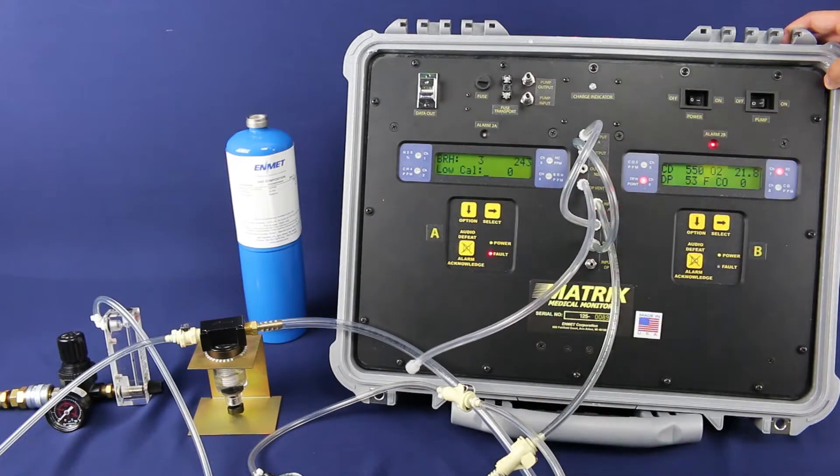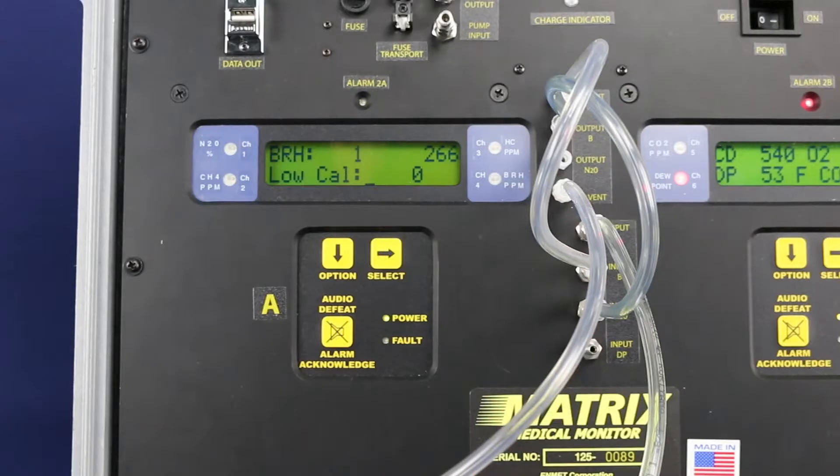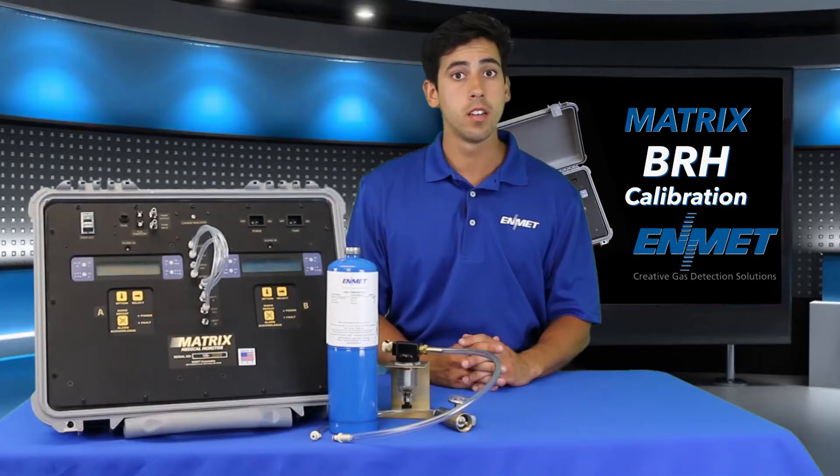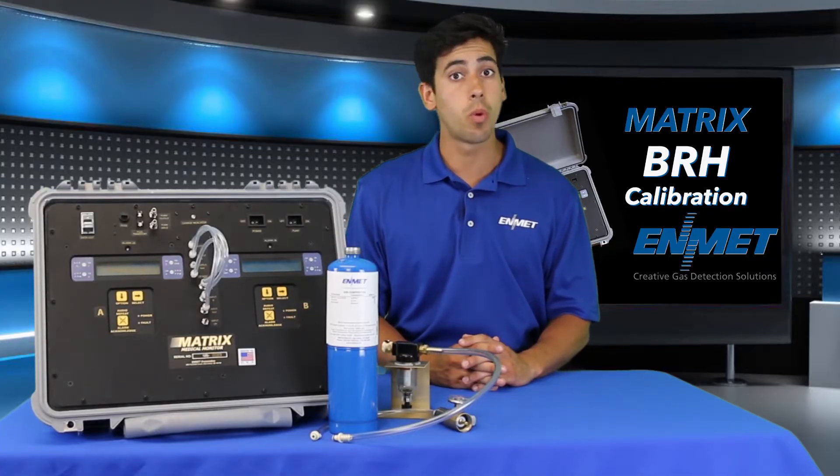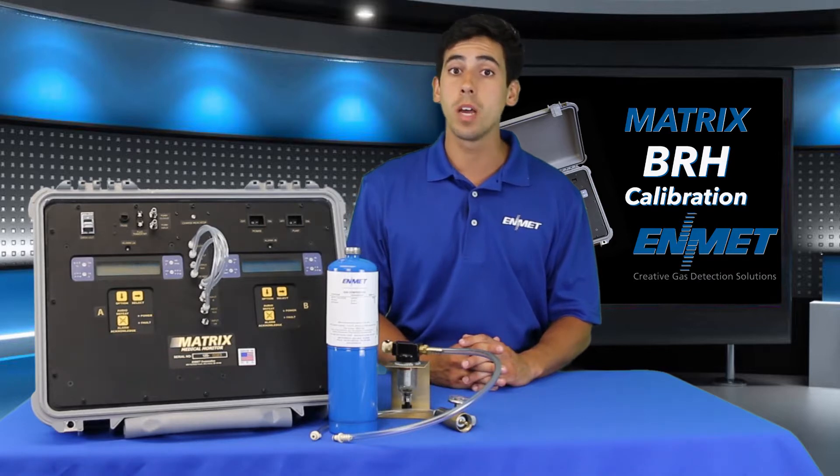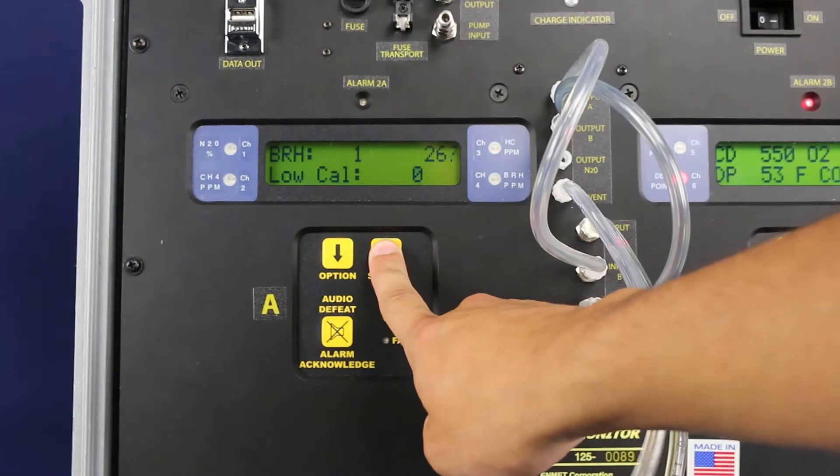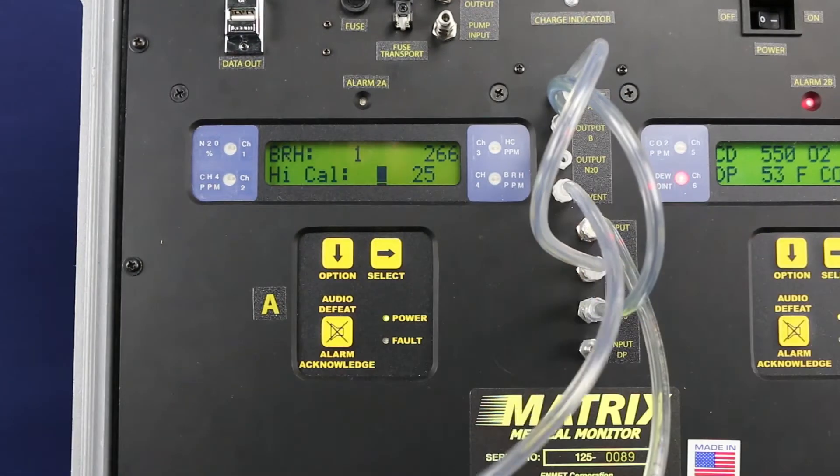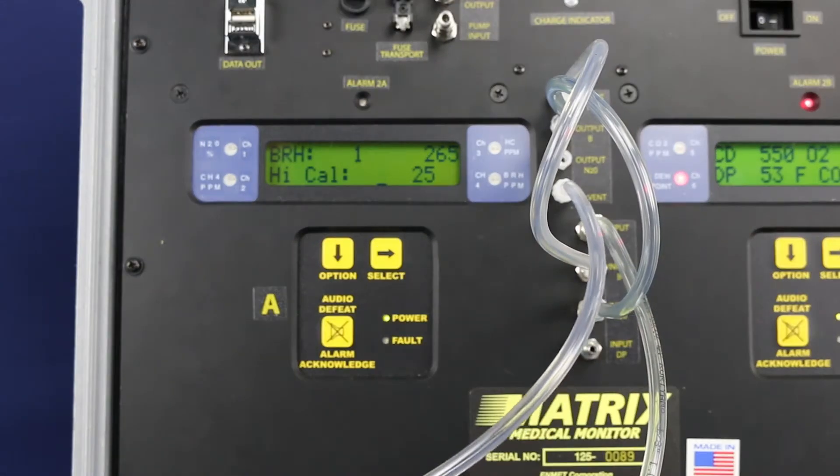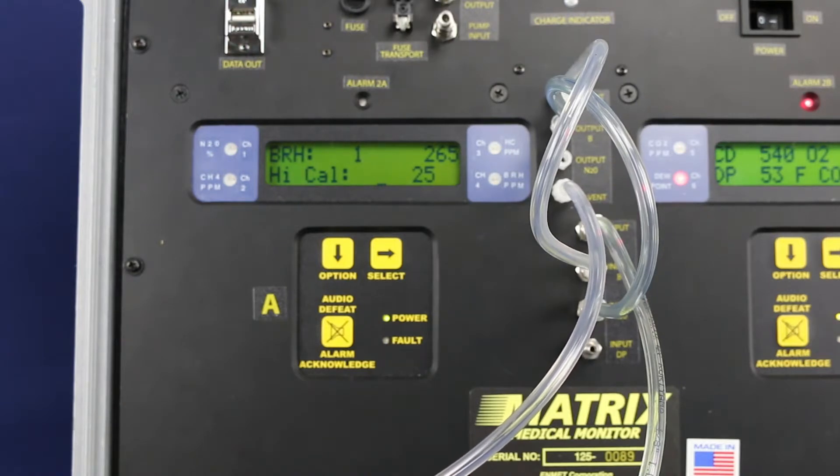After pressing the select button, you will see low cal on the bottom row of the display. Since the instrument has been connected to the bubbler assembly for 20 minutes, you will now accept the zero calibration. Press select to move the cursor over to the right, and when it gets to the last digit, press select one more time to accept the zero cal.